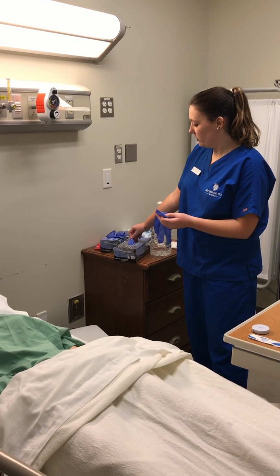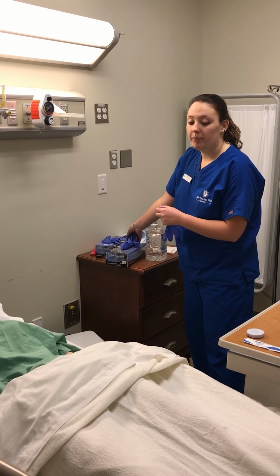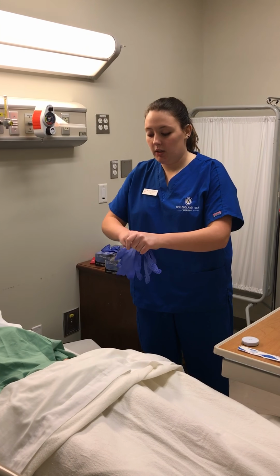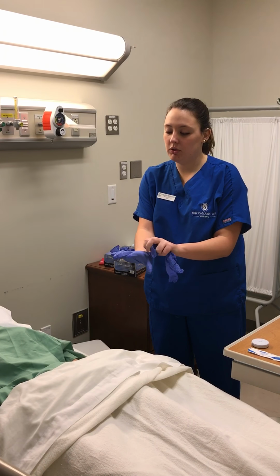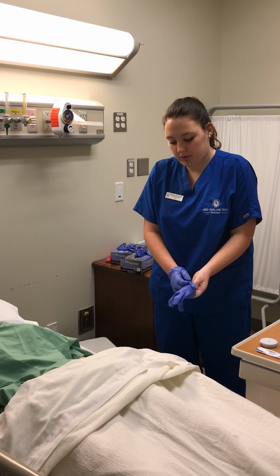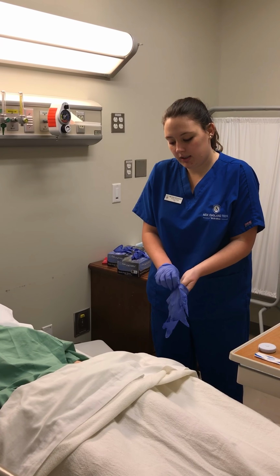And then I'm going to put him in the appropriate position, which he already is in. Now the positions vary depending on where the wounds are. Jimmy happens to have an abdominal wound, so lying down is how we're going to assess it and change it. Okay?